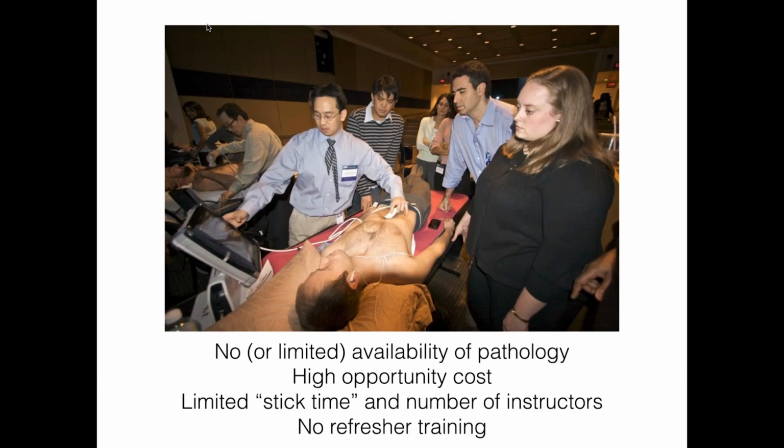So you have to think about how training in ultrasonography is currently provided, and most of it is done through these types of crash courses. And this picture is very telling. You can see here that we have a patient. It's a standardized patient. These are generally healthy individuals. He's listening to his iPad. He's got no acute medical condition going on right now.